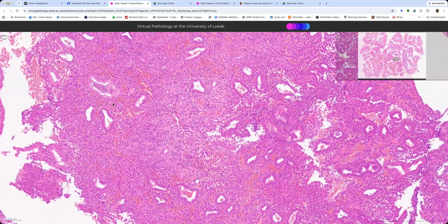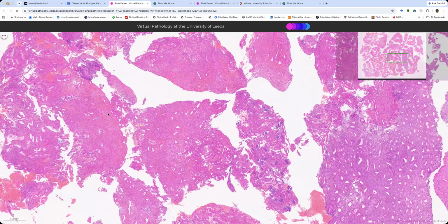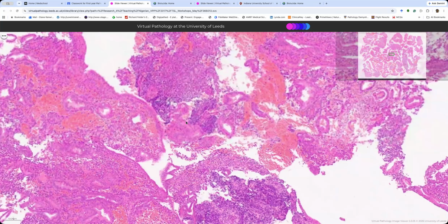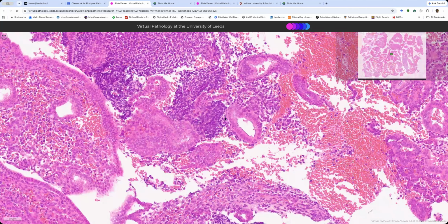But often the clue to whether this is menstrual phase, and I'm just looking for it, is in the stroma, the little blue balls of stroma. All right, so there's some here because the stroma, as well as falling apart, you've got to think, oh, it's just the pressure being too much on the curettings or things. We get this stromal condensation. Okay, so often we talk about blue balls.